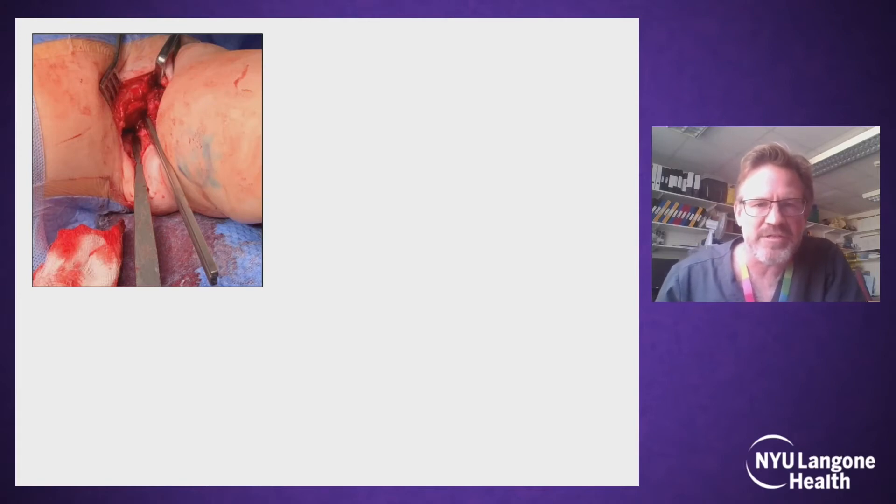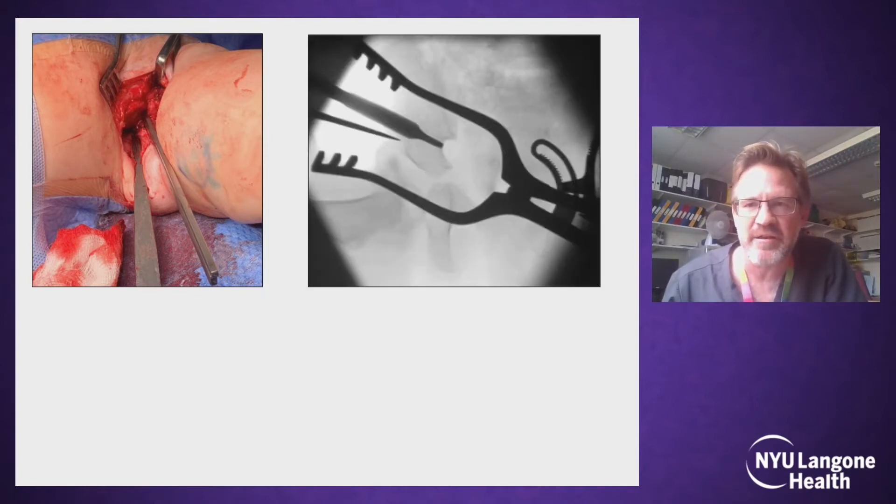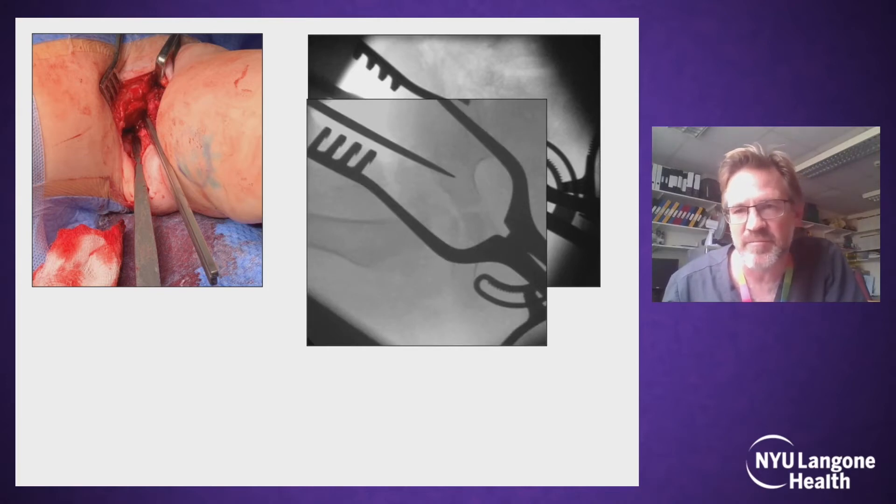Here is an intraoperative photograph of a right hip. The baby's head is across to the left and the right hip is up, flexed, reduced, and the capsulorrhaphy performed. You can see the ilium, the apophysis split, and the two osteotomes in. The larger osteotome — the eight millimetre one — is placed in the mid-axial line, just on the lateral aspect of the acetabulum, and you can see the entry point here. It is advanced about halfway across the acetabulum, which is usually about a centimetre.